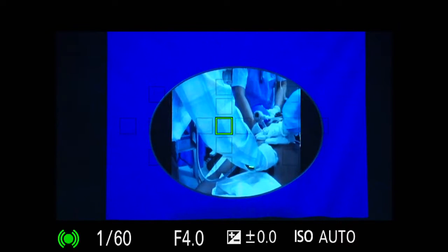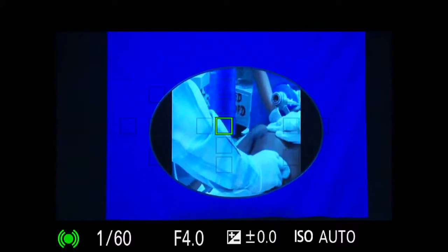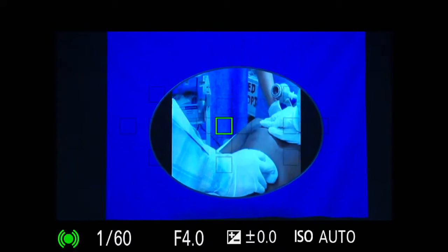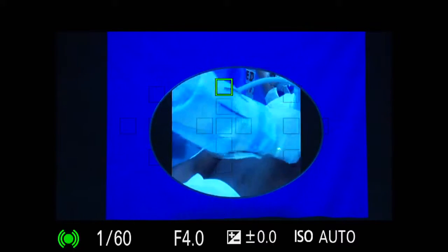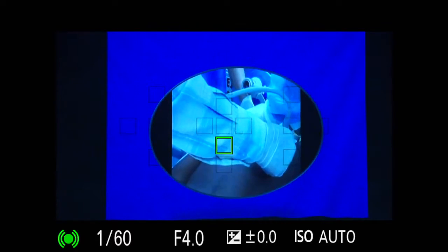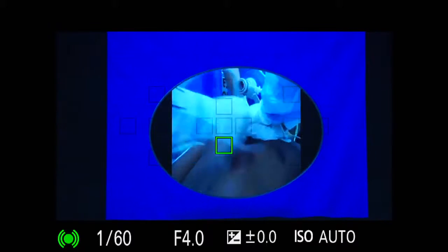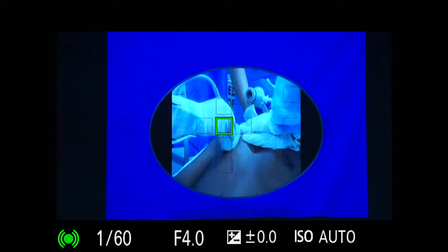How do you actually do it? You just see. You use a curvilinear probe, sub-xiphoid view, and take less than 10 seconds for the first rhythm check. Then you look at the lung window, 5 seconds on each.